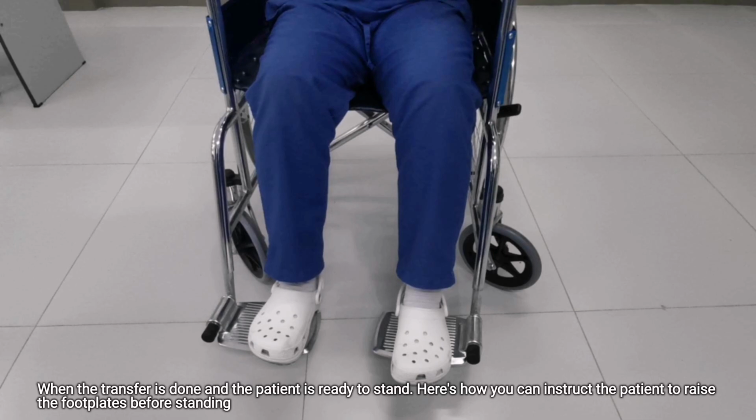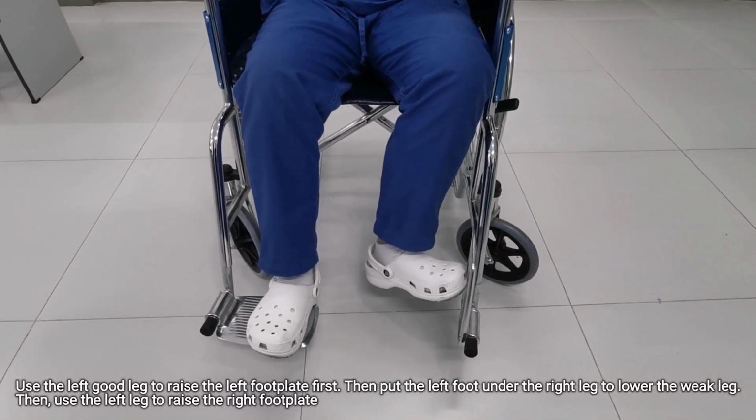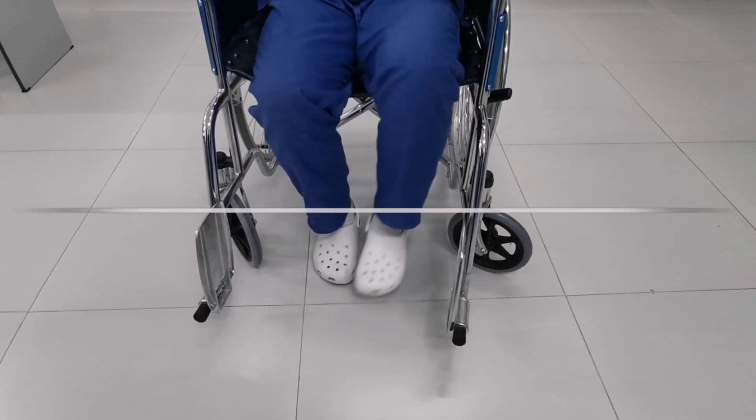When the transfer is done and the patient is ready to stand, here's how you can instruct the patient to raise the foot plates before standing. Use the left good leg to raise the left foot plate first. Then put the left foot under the right leg to lower the weak leg. Then use the left leg to raise the right foot plate.